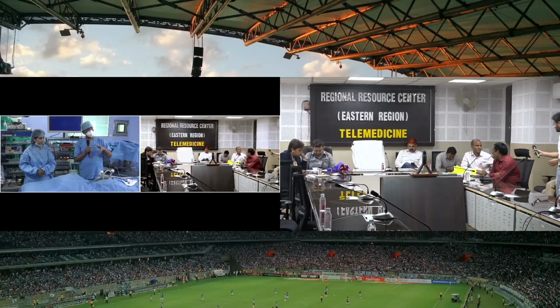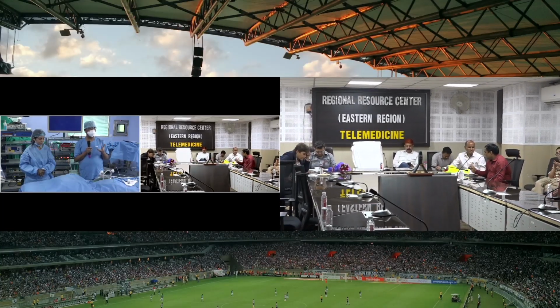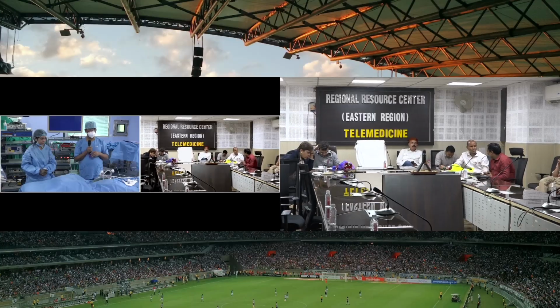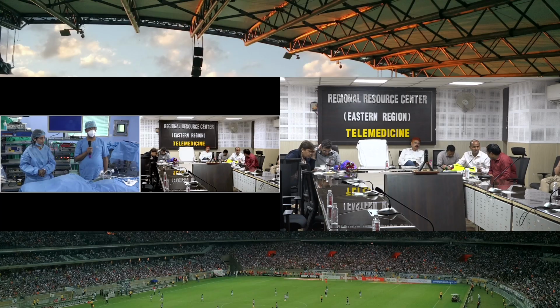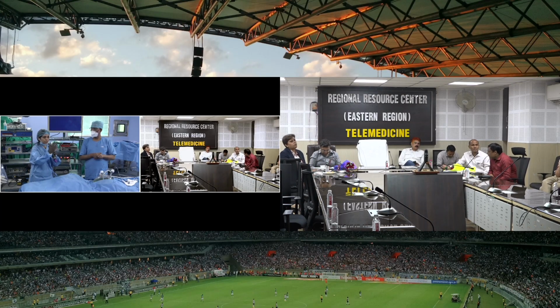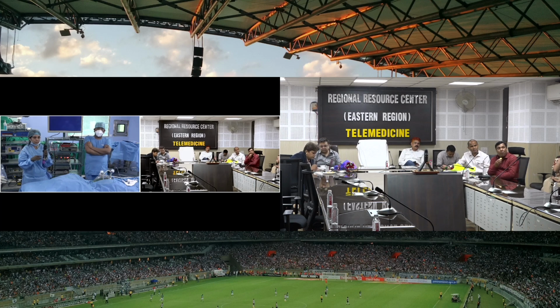A single port you can use, like in single port surgery. So no issue with the single port. But usually the double port is better, because sometimes you have to take the biopsy, and it would be easier. But theoretically you can use a single port. There are those modified ports where there is a single port and two outlets that you can use, but you cannot mix the outlet system with capnoperitoneum and all that, so it's not advisable. Everything can be done in an experimental setting, but it's not advisable for everybody.